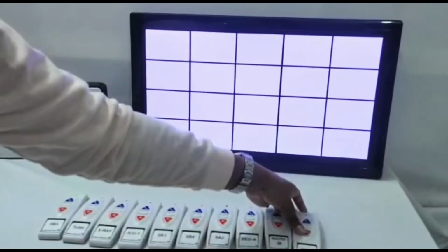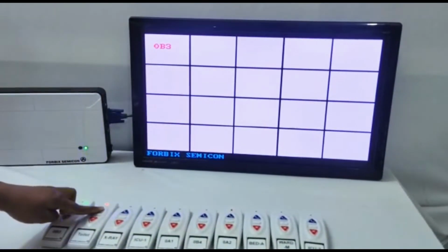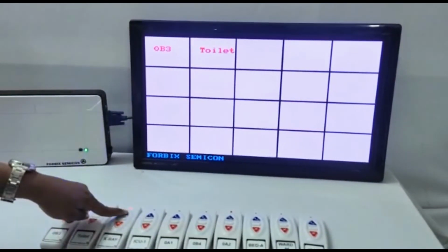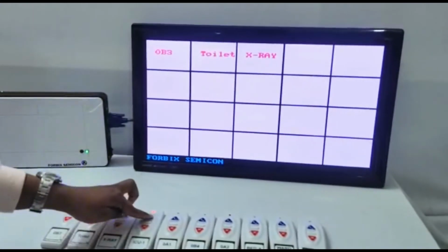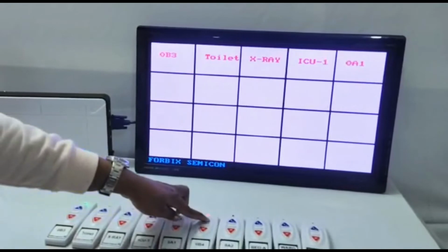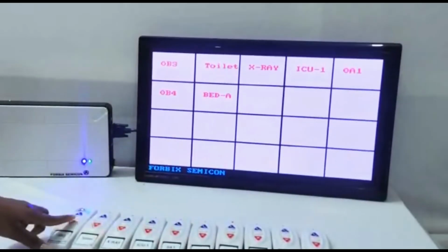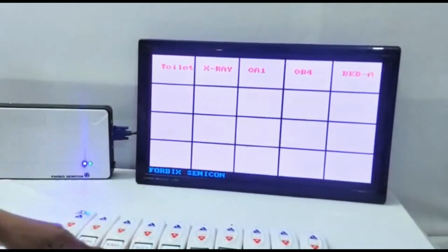The receiver unit also serves as a data logger. It continuously records the time when a remote was pressed, and the time when the person was attended. This data can then be post-processed for weekly or monthly profiling. The log data is saved in a removable SD card.